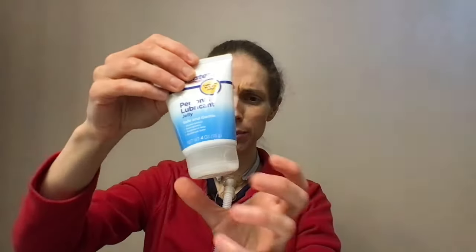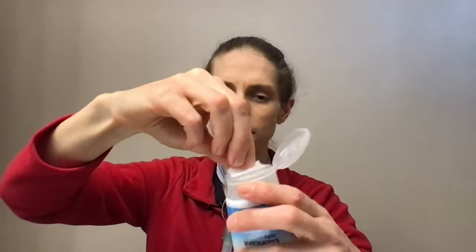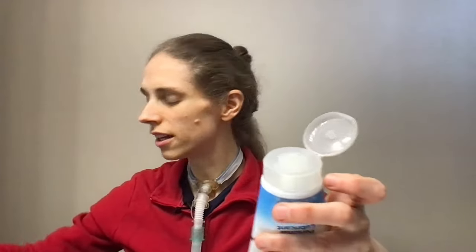Next, I'm taking my lubricant jelly. I'm going to open it and wash it off with this alcohol wipe. Okay, here we go. I think that looks pretty good. Yes, all right. Now I'm going to take a tiny little bit, and when I mean a tiny little bit, I mean a tiny little bit. Don't put a lot on here because you're going to put that in your airway, and you're going to be choking on lubricant jelly for the rest of the day. So put a tiny bit in, and that's what I'm going to do here.